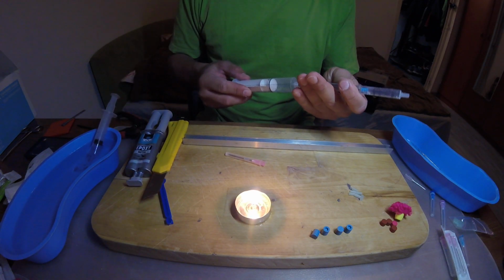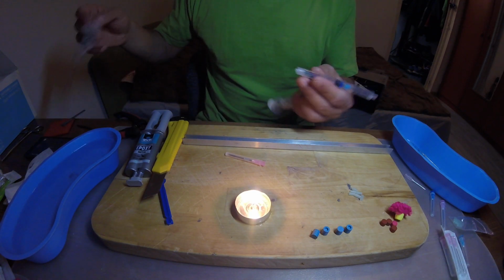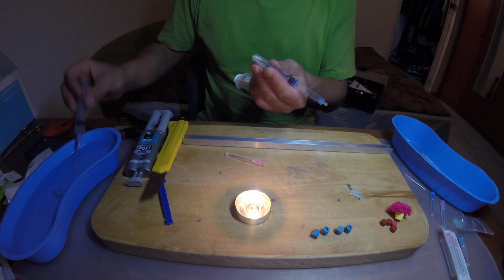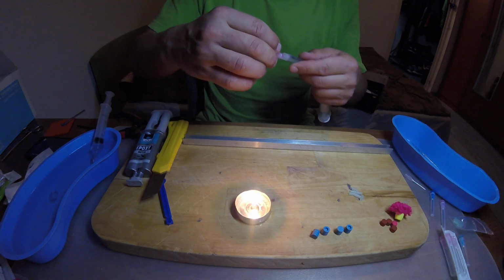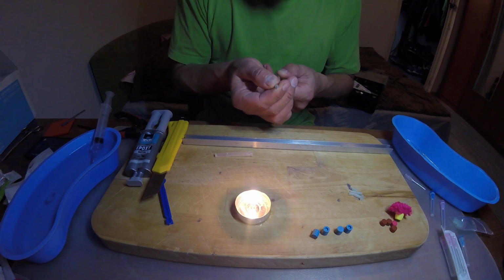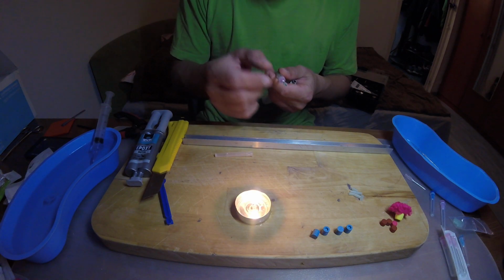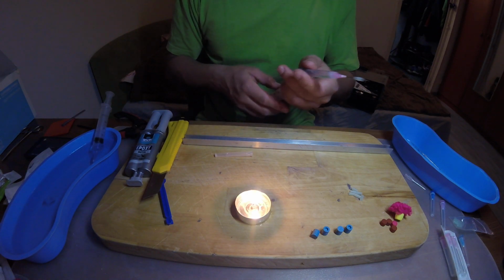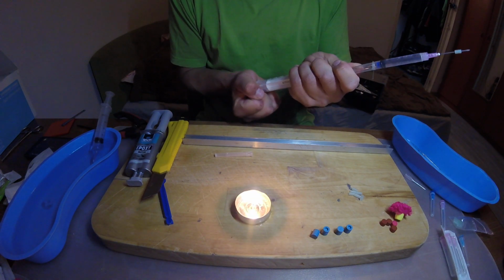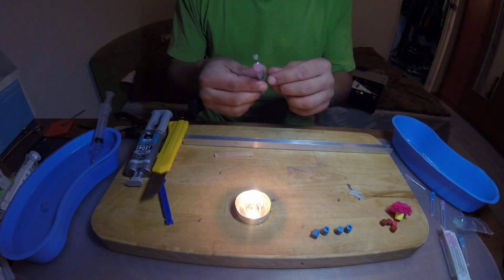So first of all, we push the piston back, put in some water in this case, but this is where the substance goes inside. Yeah. And then push our needle. We put a sleeve, the rubber sleeve. This rubber sleeve is going to be put on the hole that we have made before, and then we are going to push pressure on the other side, and now the system should work.